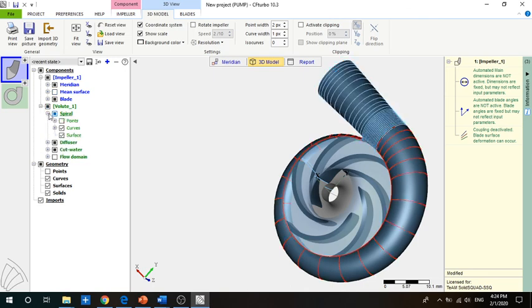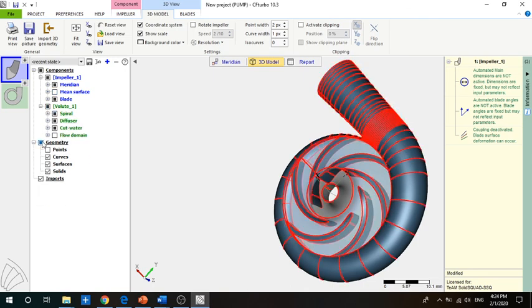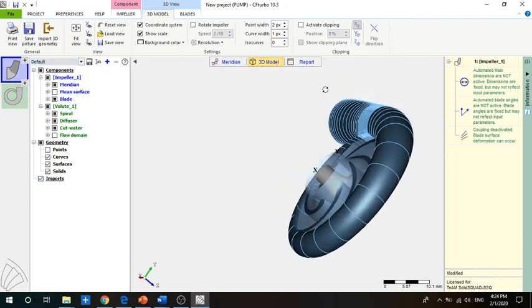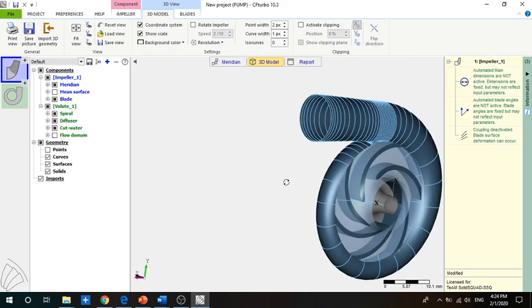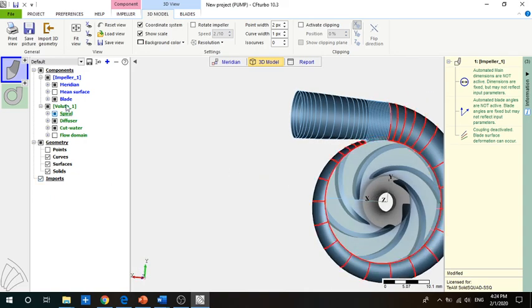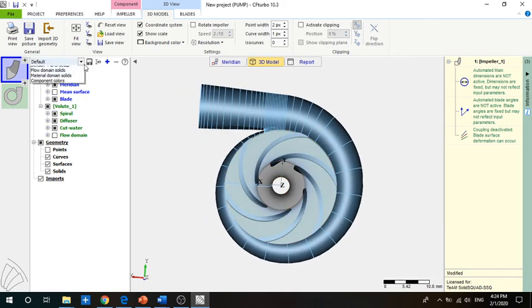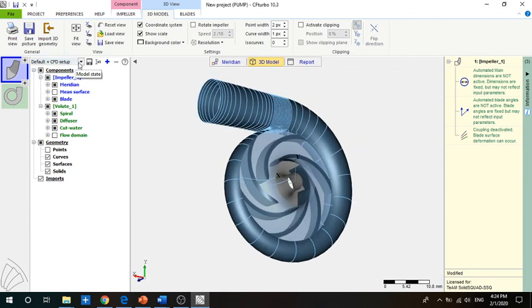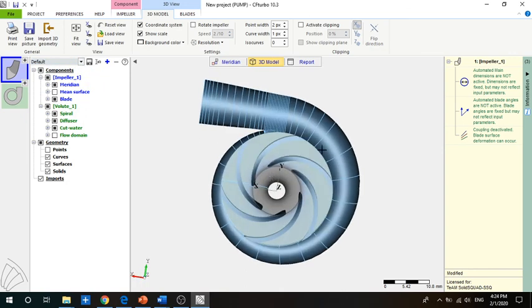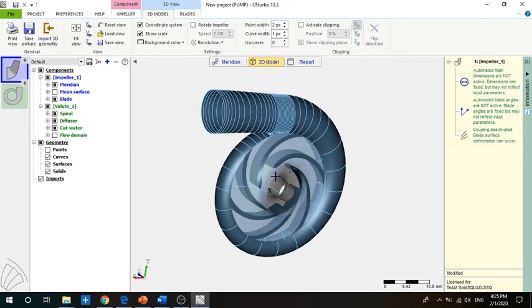You can choose to show points, symmetry, or any other display options, but mostly you will go for the default value. For the CFD setup you go for the default CFD option. So we have here created the impeller with the volute. This is the end of the first video.